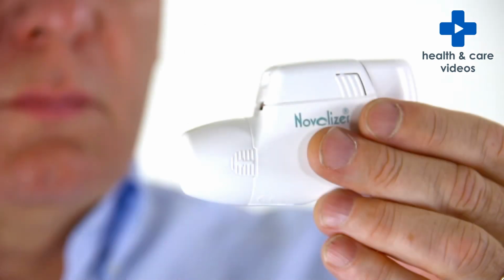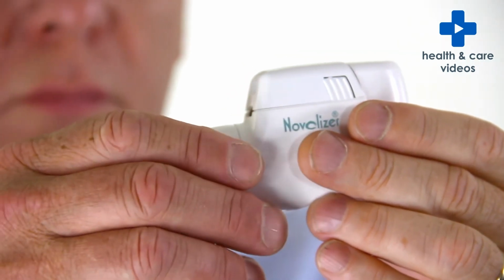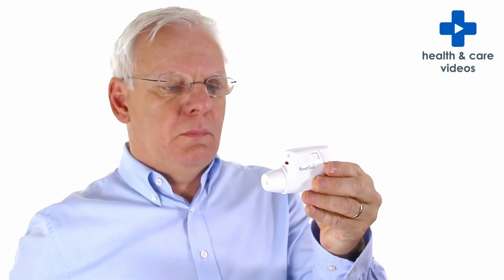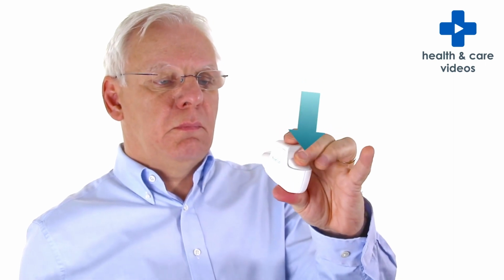You should always sit upright or stand up when using your Novolizer Inhaler. Start by removing the protective cap from the mouthpiece by lightly squeezing the arrows on each side of the protective cap and pull. Hold the inhaler horizontally with the mouthpiece pointing towards you and the button pointing upwards. Press the button all of the way down and then release it.